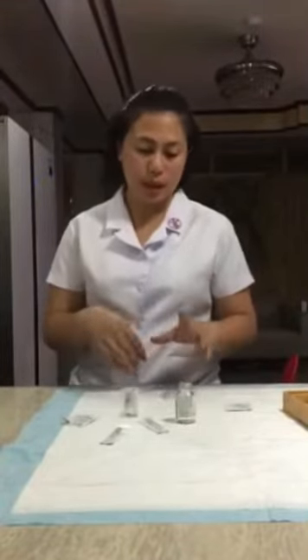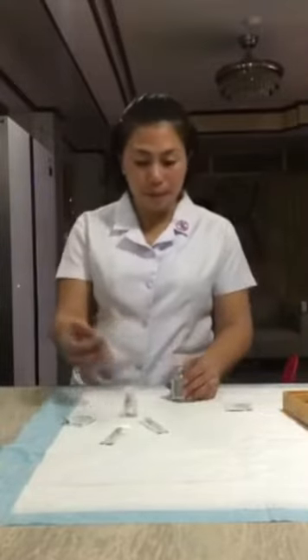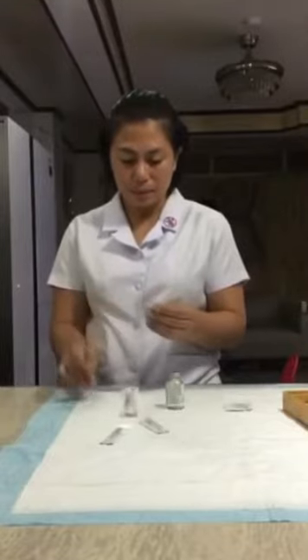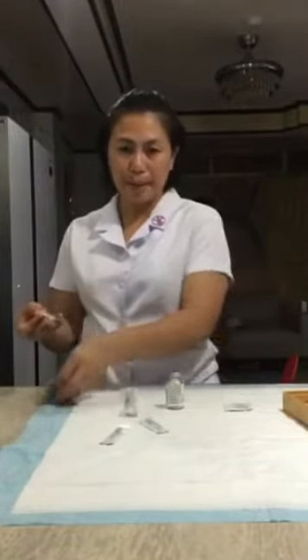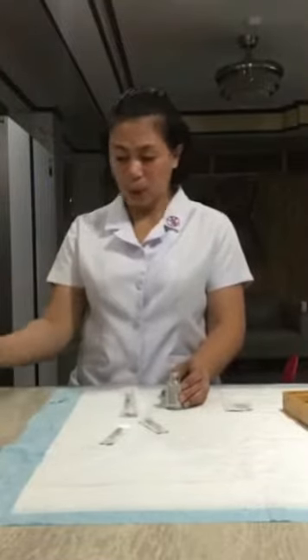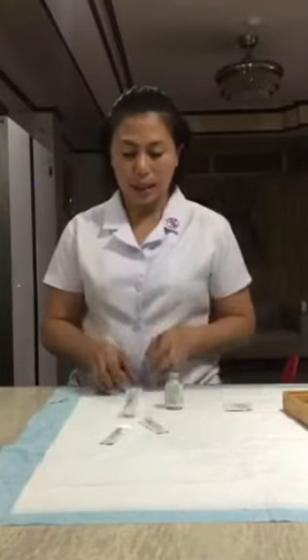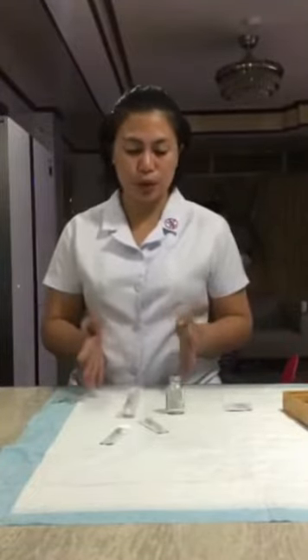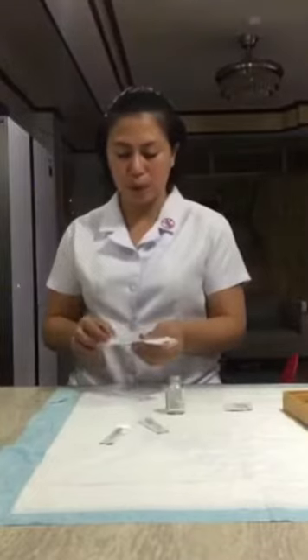So let's go ahead. Let's remove the cap and let's clean the rubber cap in a circular motion from inner to outer rotation. We already know that we always clean to deter the spread of microorganisms or reduce the microorganisms. So after that, withdraw the medication.